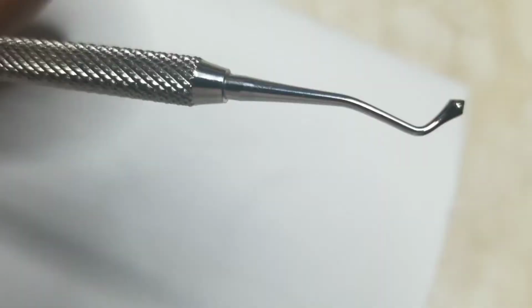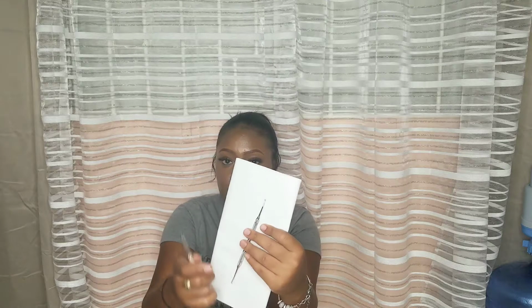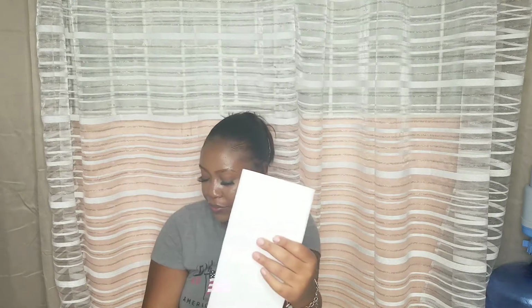Then you have this one, which is an Acorn burnisher. I should probably show you the bigger one because you'd be able to see it. This is a small one and I have a bigger one. This is what the Acorn burnisher looks like. Again, I'm going to take pictures and insert them just in case you guys can't see.